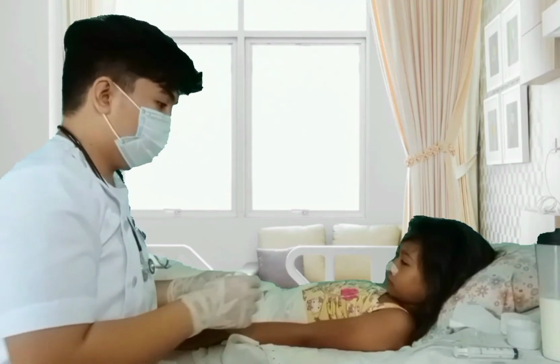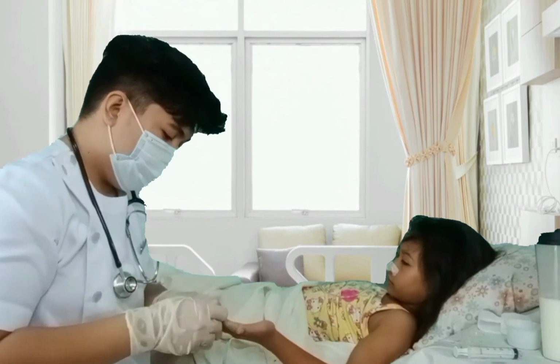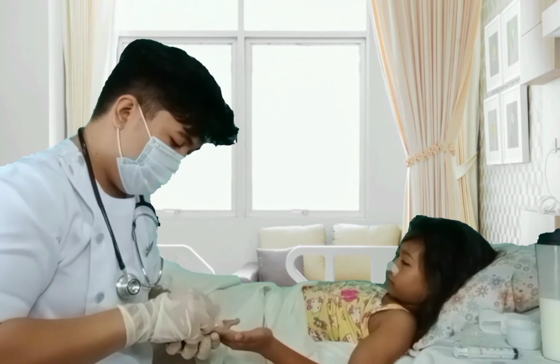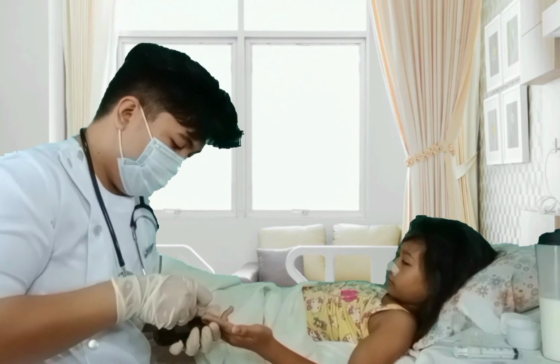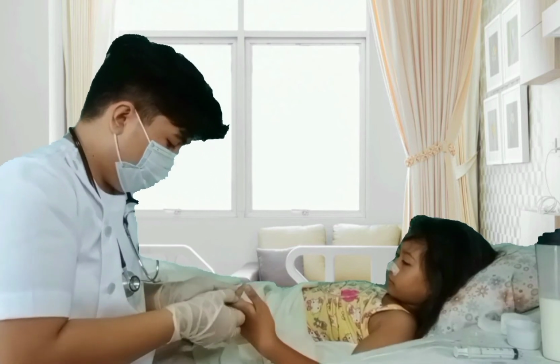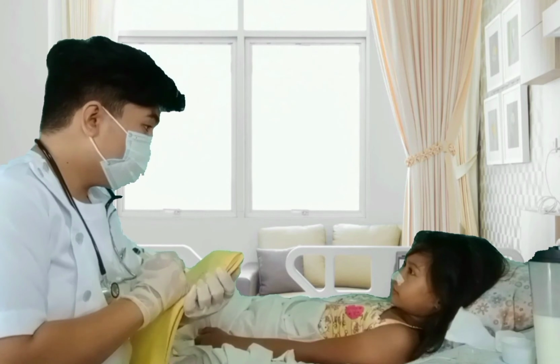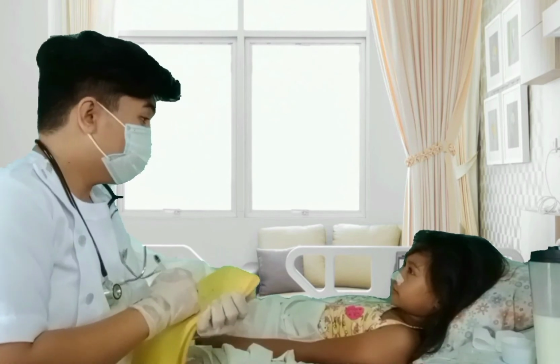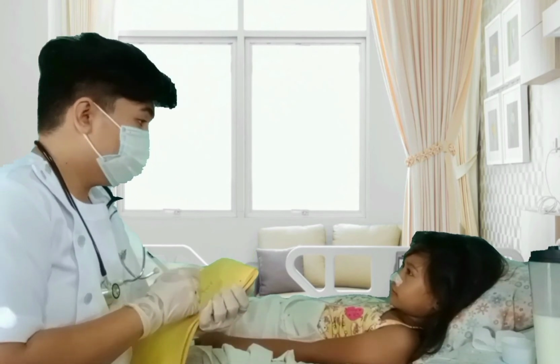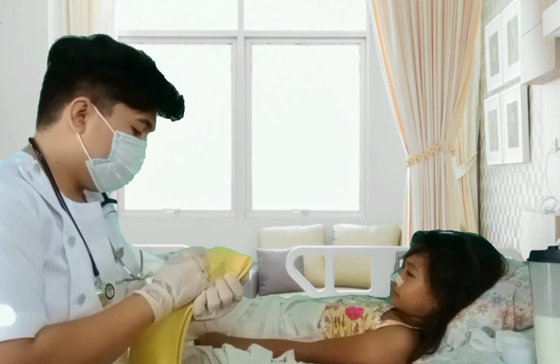Step 12. Monitor finger stick blood glucose every 6 hours until maximum administration rate is reached and maintained for 24 hours. Alert nurse to client's tolerance of glucose. Step 13. Monitor intake and output every 24 hours. Intake and output are indications of fluid balance or fluid volume excess or deficit.